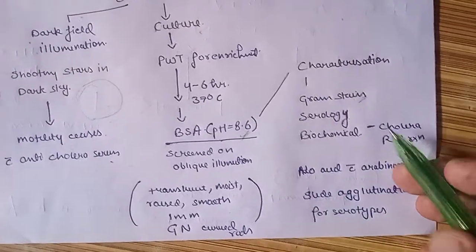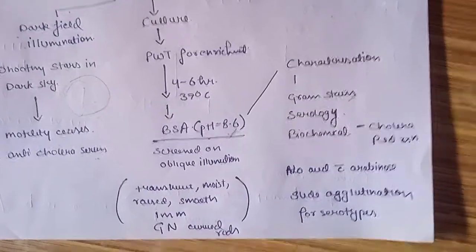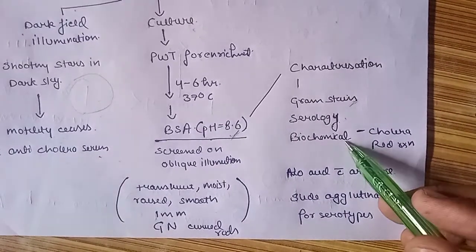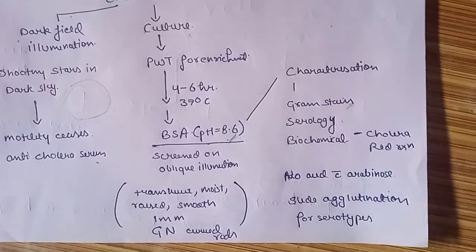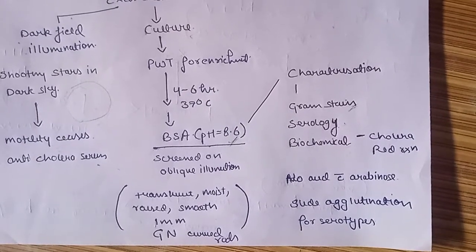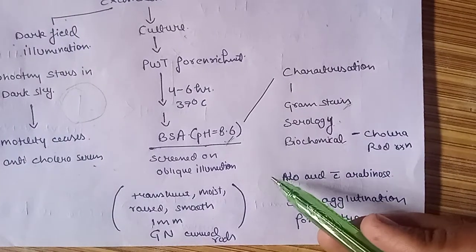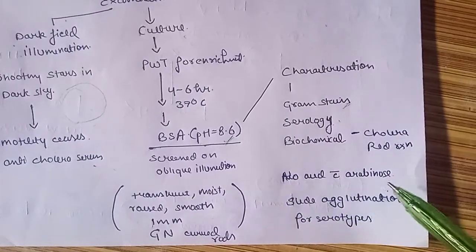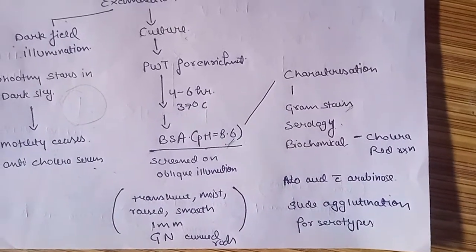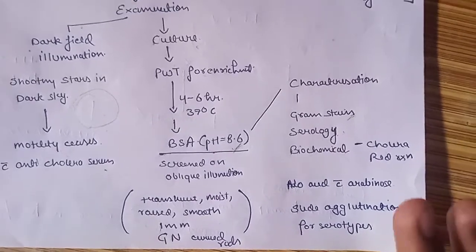Again, when we do the serology, okay, so while using the specific anti-Vibrio serum, we may see the agglutination. The characteristic biochemical reaction in the case of Vibrio is cholera red reaction, which is due to nitroso-indole compound. And one more characteristic is the Vibrio do not form acid with arabinose. For diagnosis of specific serotypes like Ogawa, Inaba, and Hikojima, we use slide agglutination.